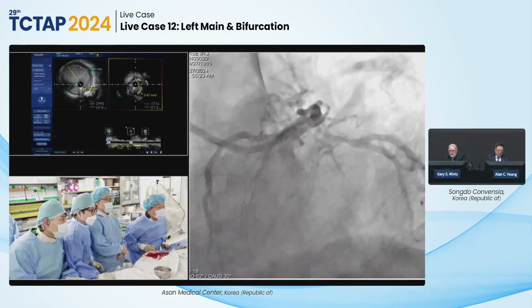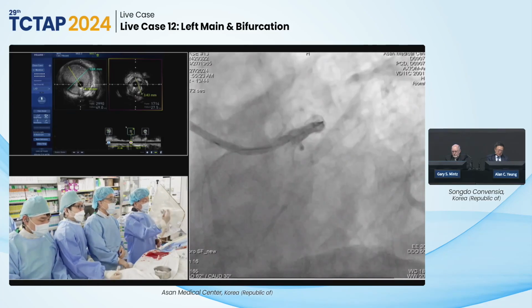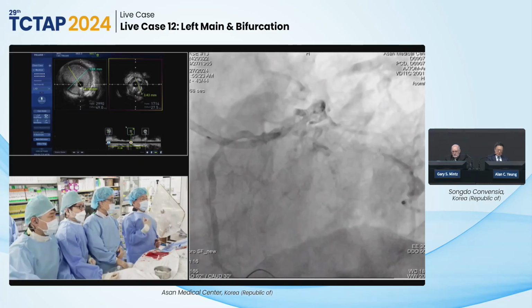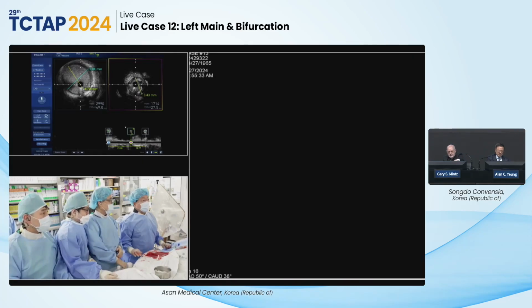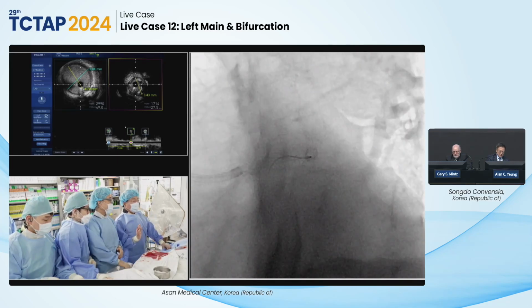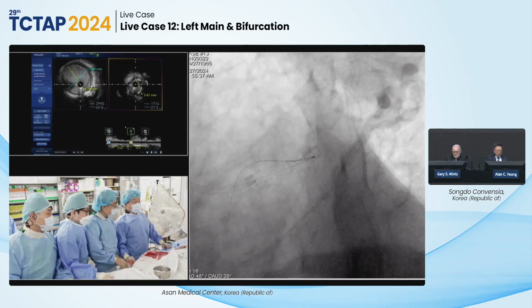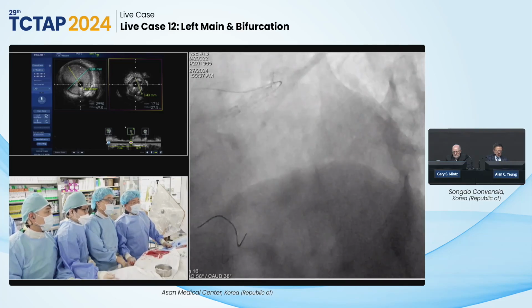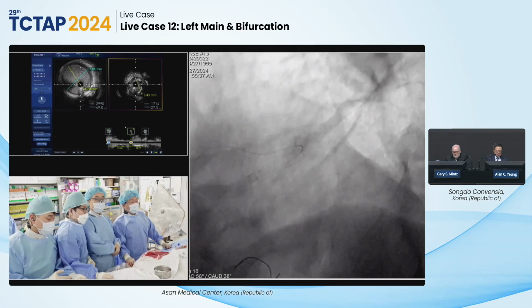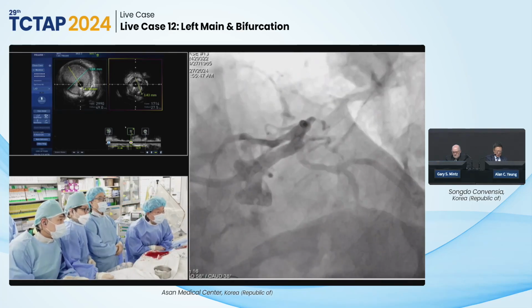It's really okay. I think it's, yeah, angle is, this is maximal angle. Going to about AP caudal, almost there. Oh, no. More angle. I think it's okay, right? Good, perfect. You want to see a little bit more detail in the circumflex ostium?